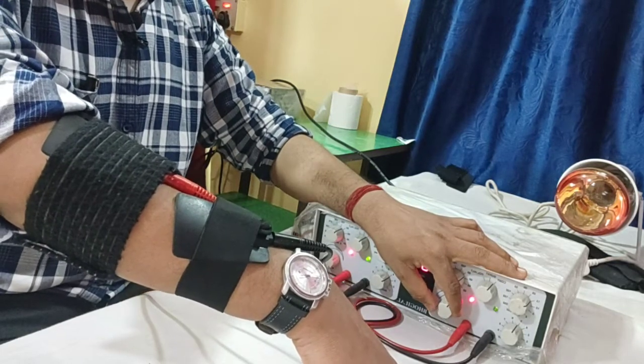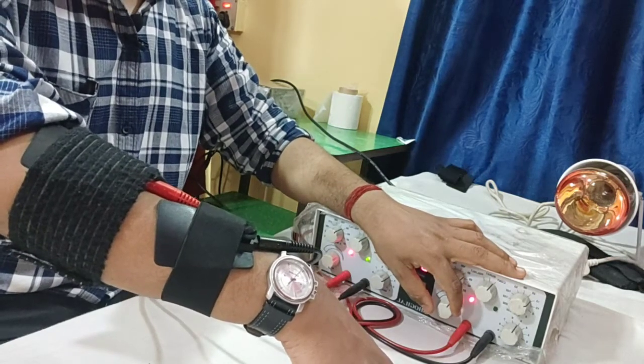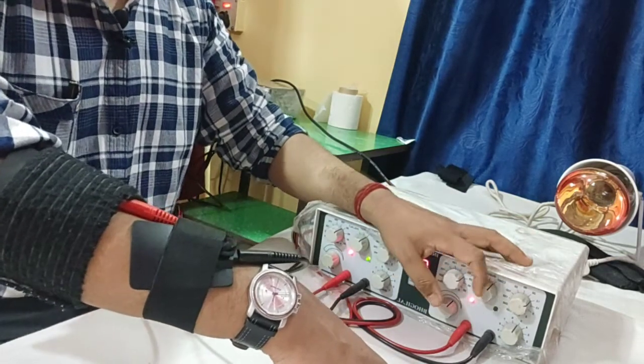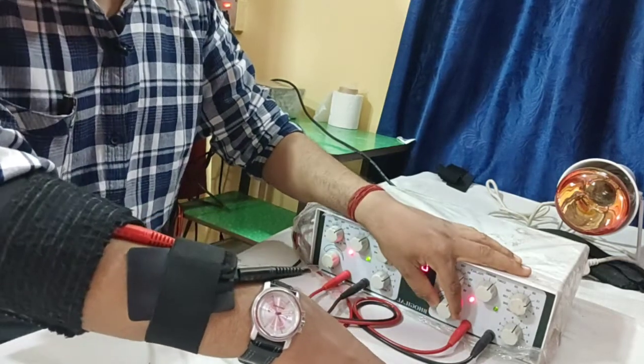Very low current is coming to my hand, and this brief intense TENS is used whenever a patient is having post surgical pain, any scar tissue formation and related pain, any phantom limb pain. That is the time this brief intense TENS is used. Again the duration for this brief intense TENS is 20 minutes.